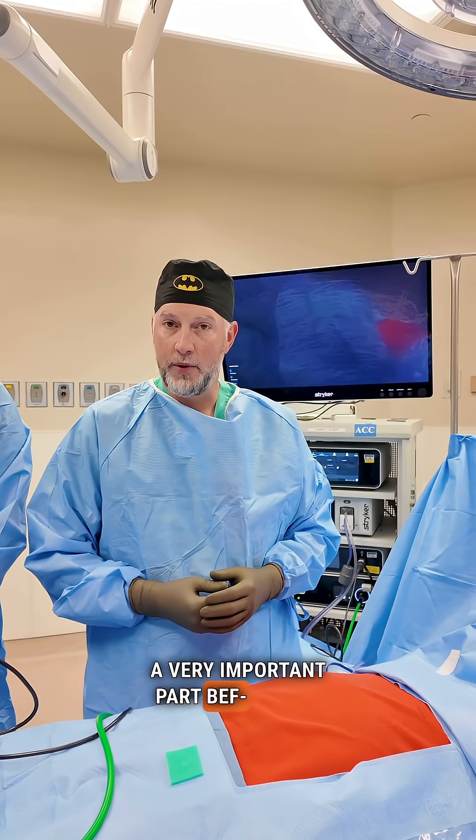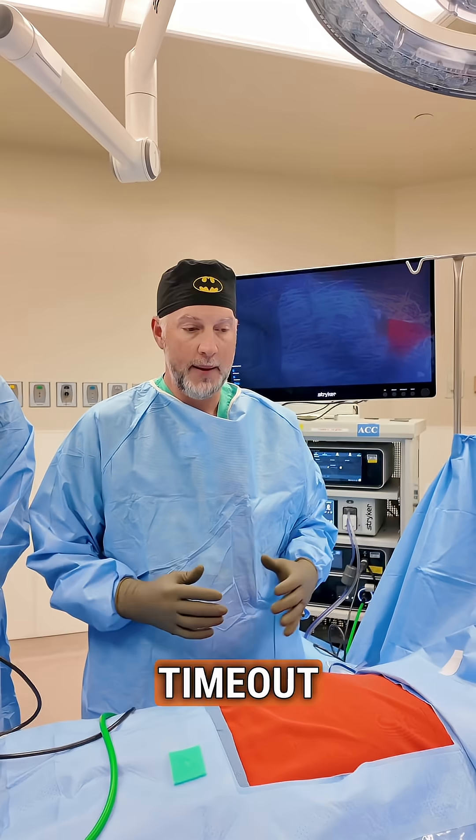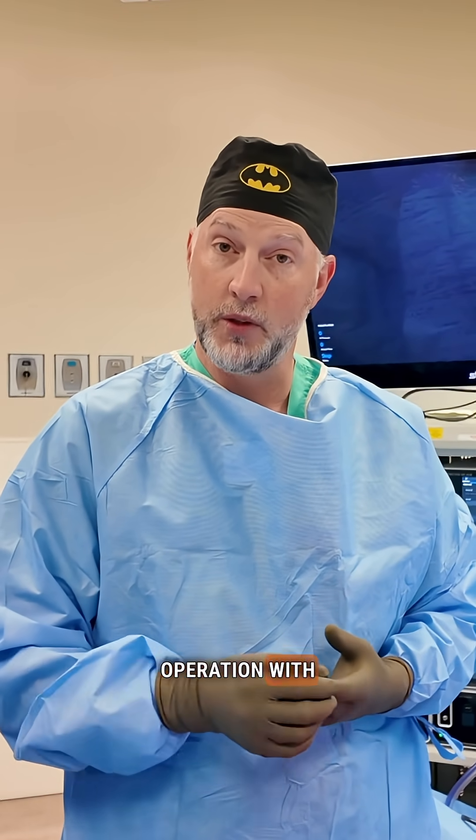A very important part during any case, and actually before any part of the procedure is performed, is what we call the timeout. A timeout is where everything in the room stops and we all focus on the patient: do we have the right patient in the right setting, doing the right operation with the right equipment?